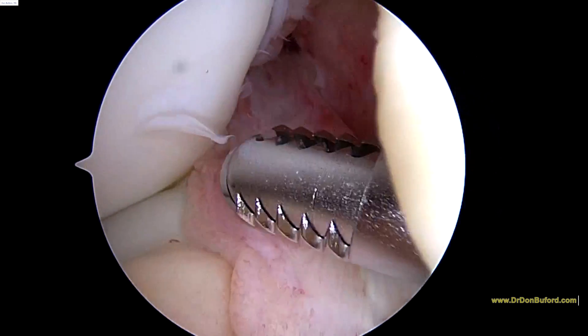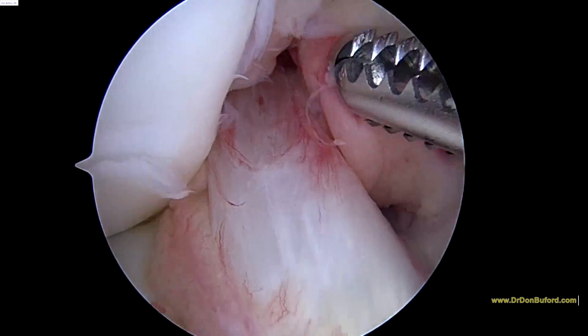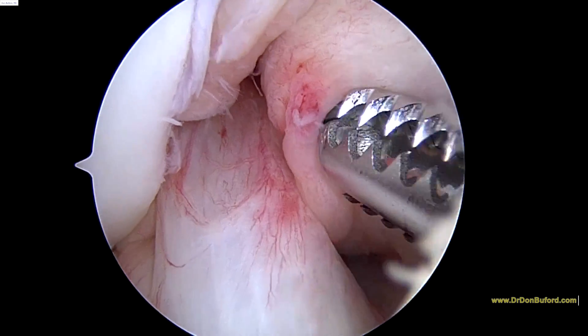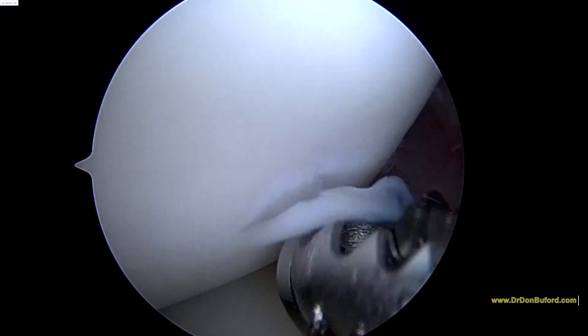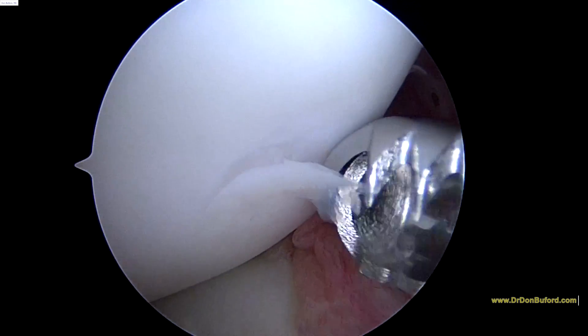We're going to look at the central part — this is where the anterior cruciate ligament is. This is your anterior cruciate ligament right here. Your posterior cruciate ligament is behind this little fat pad over here, behind the shaver. The ACL right here is running along the tip of the shaver. Here's a little interesting area in the condyle — maybe scoop that out with our shaver.